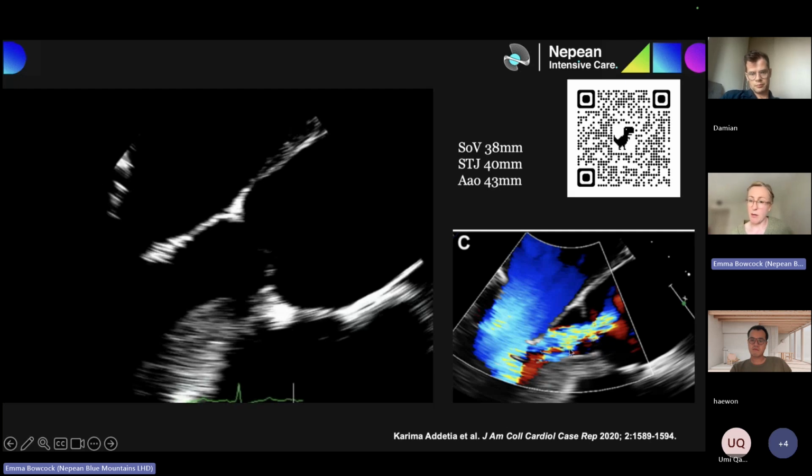And this was the jet of that patient. So you can see quite a broad central jet with flow convergence, which we're going to talk through, and a fairly wide vena contracta. I can't remember what it was. I think it was in the moderate category, actually. And then you've got jet expansion in the LVOT.